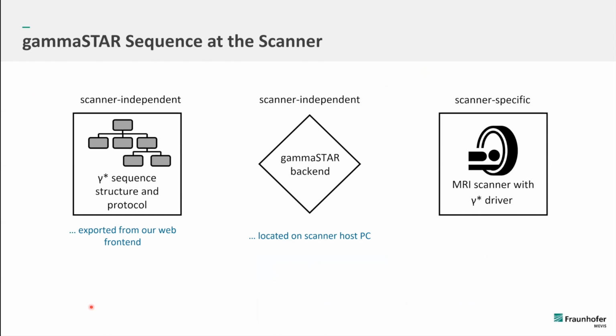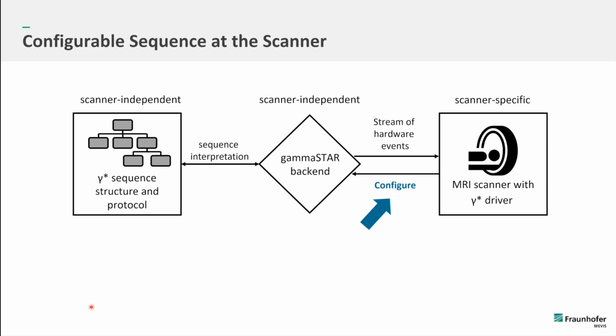So we do have a driver, and sorry for going over it so quickly. We do have a driver concept which covers the hardware component to control the MR scanner. And this is able to deal with a stream of hardware events our GammaStar backend is providing and playing it out on the MR scanner.